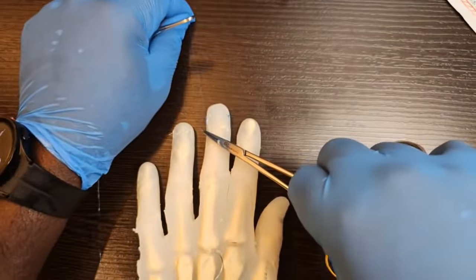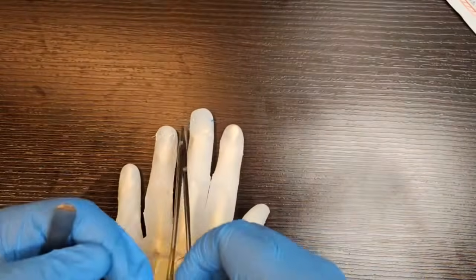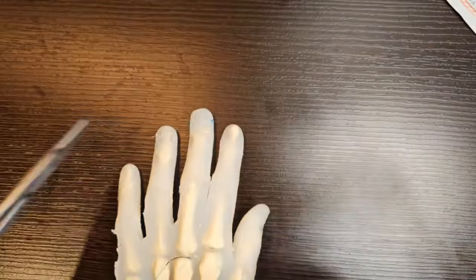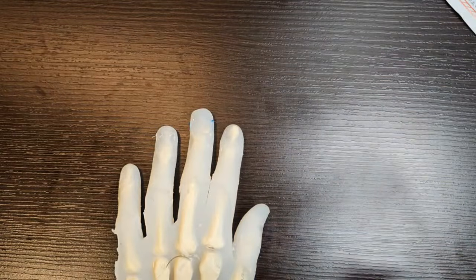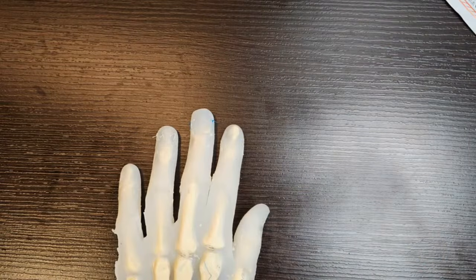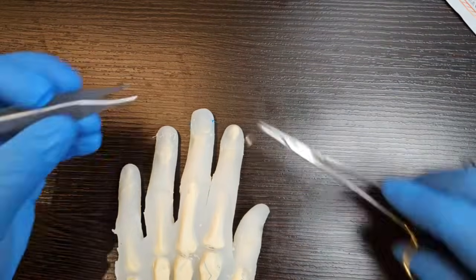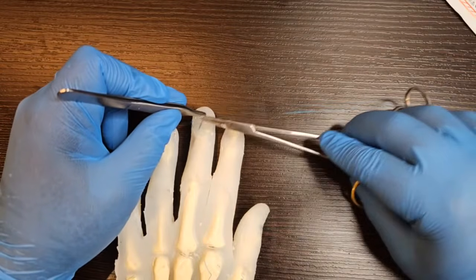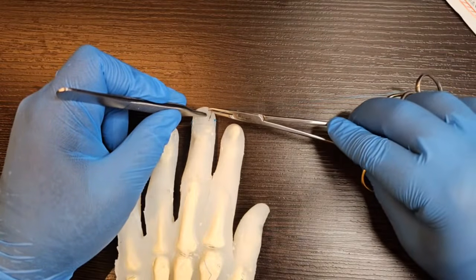So nailbed injuries, really common in children because they often have their fingers in doors and somebody closes the door. So that's the paronychial folds and pulp injury repaired. Now we need to do the nailbed injury itself. So lots of options. You can do a continuous suture, you can do interrupted.